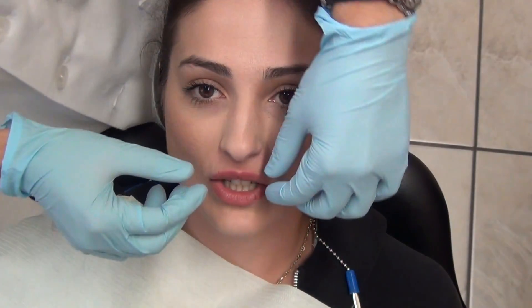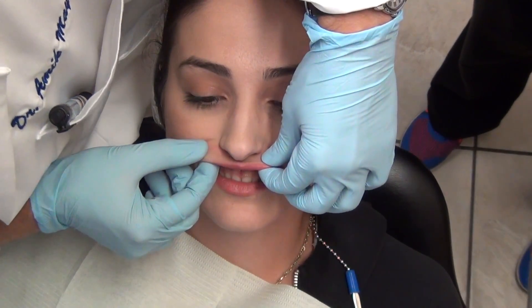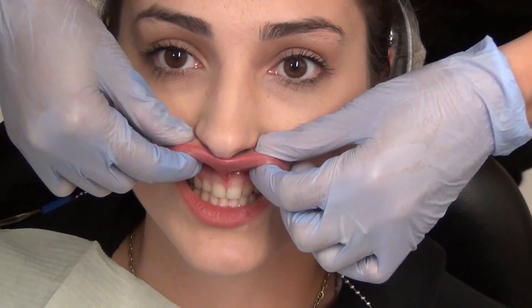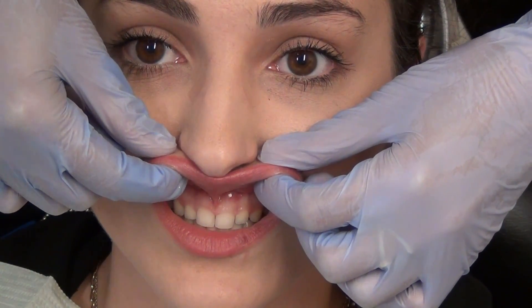Okay, so we're getting ready to do a frenectomy. Let's see if we can see the lip here — you can zoom in if you have to. I'm gonna zoom in and out. Yeah, like that. Make sure this is better. Okay, yeah, that's good.